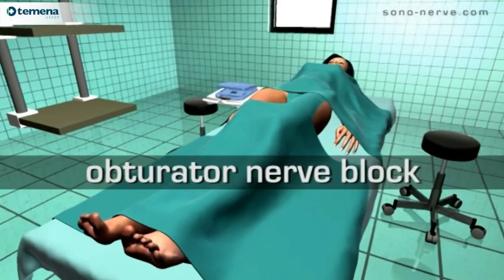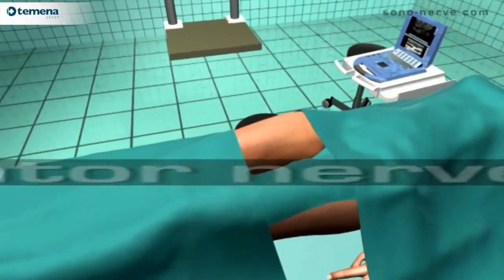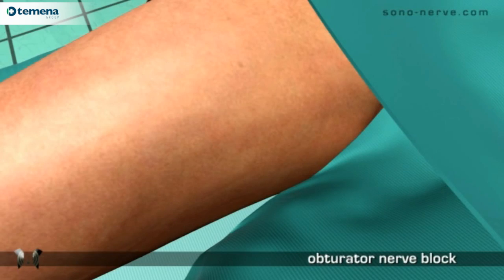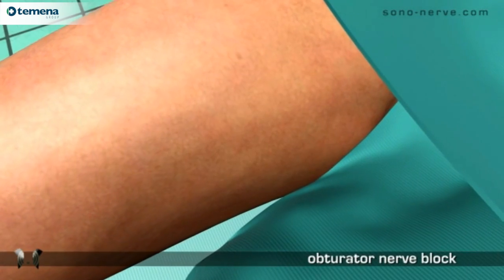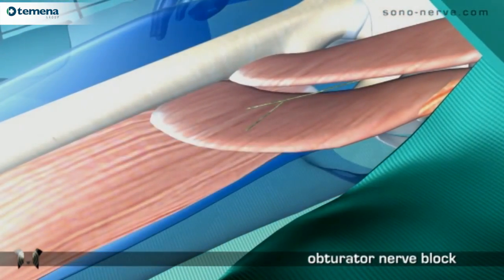Obturator nerve block. With the patient placed in the supine position and the skin prepared with antiseptic, the ultrasound probe is placed over the medial upper thigh.